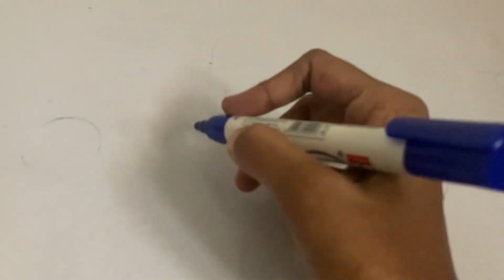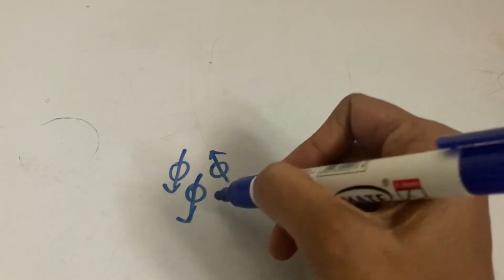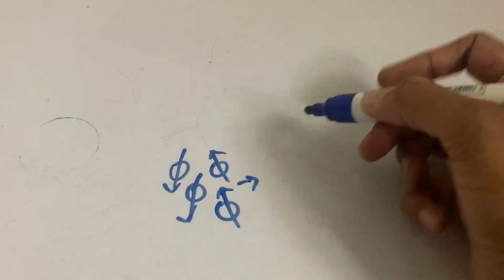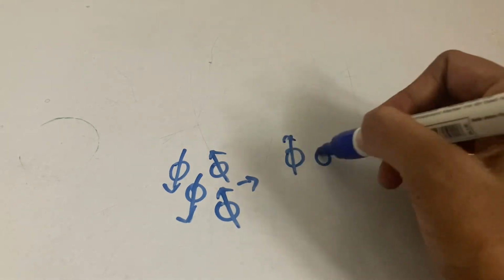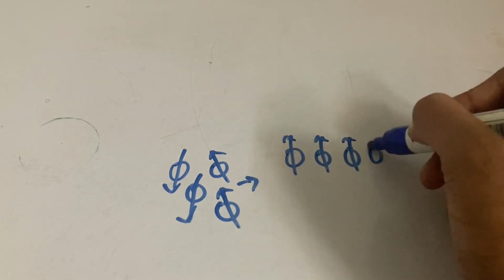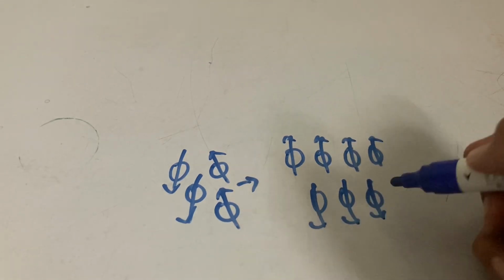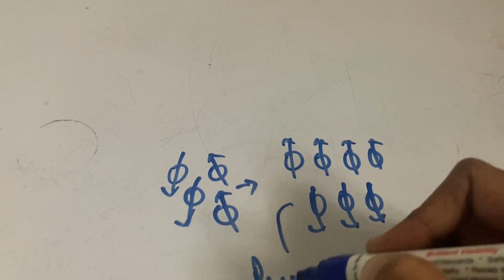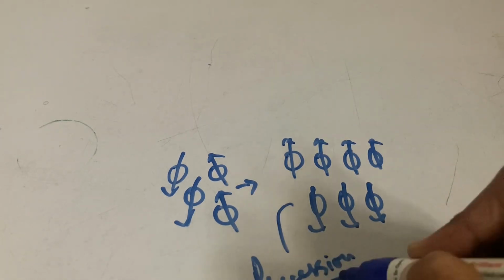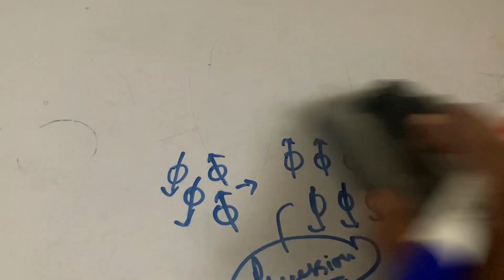Then coming back to basics, as we know, the protons are aligned randomly. When you put them in a strong external magnetic field, they align parallel or anti-parallel to the external magnetic field. They don't remain like that. They have a movement called precession, and they have a precession frequency. So now what happens?